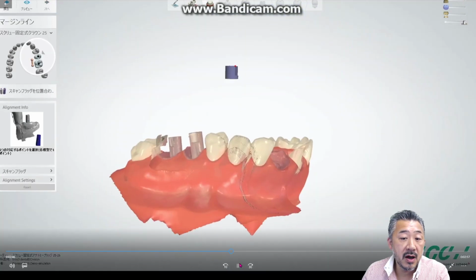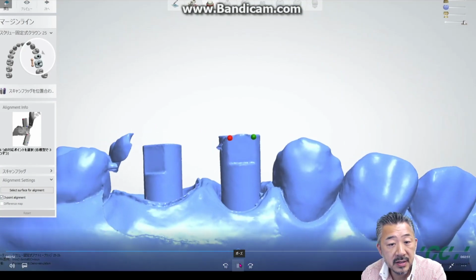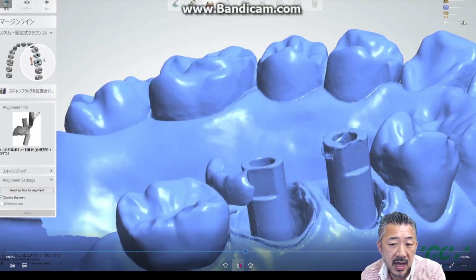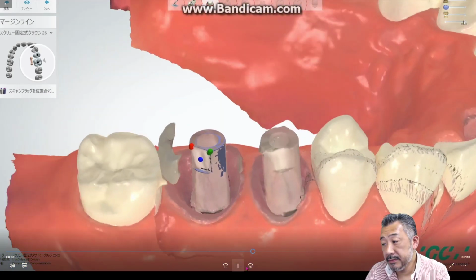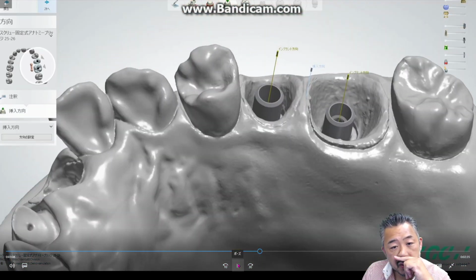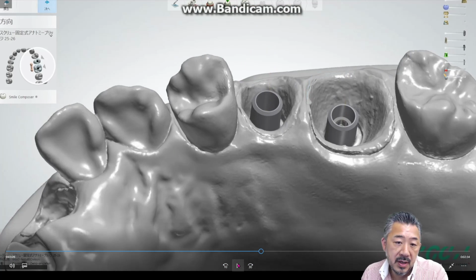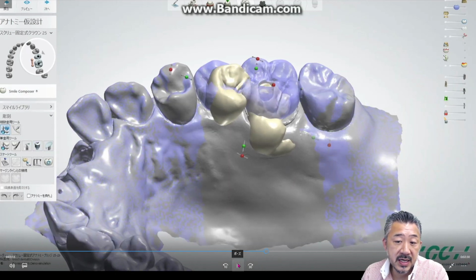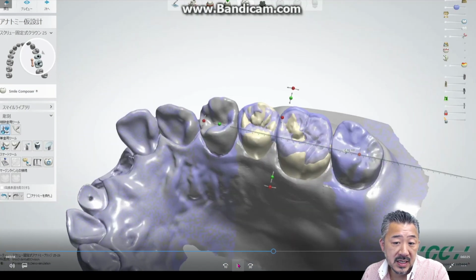So now let's do the alignment settings of the scan flag. Select the surface for alignment. In my case, I arranged a 3-point alignment, like drawing a triangle, right? Pay attention to whether the scan flag's top and the side plane overlap. Once the alignment is complete, the design is the rest. Here, I'll tell you the easiest design method.